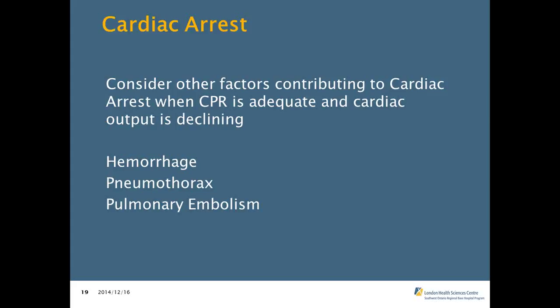So a patient has pulmonary embolus, I hook up the capnography to them, what kind of waveform am I going to see? And again, if this is just a pure issue of pulmonary embolism, nothing else going on with the patient, everyone's going to be a little bit different depending on the degree of the pulmonary embolism we're talking about. But this is an issue with the pump. So the pump, the heart is trying to pump against this large blood clot sitting in the pulmonary vasculature.